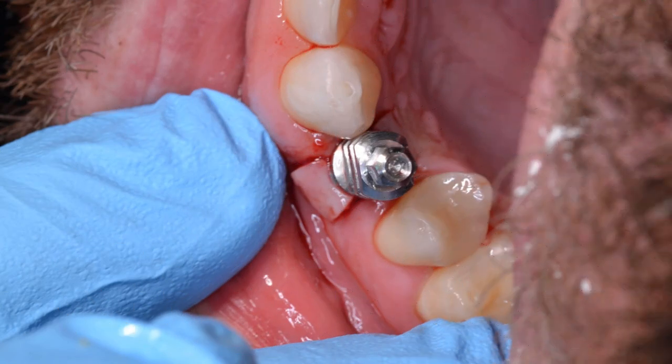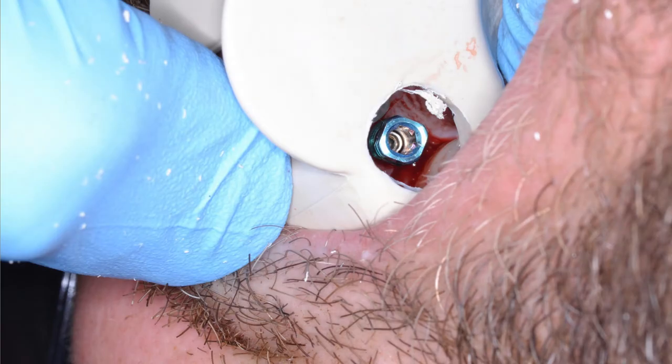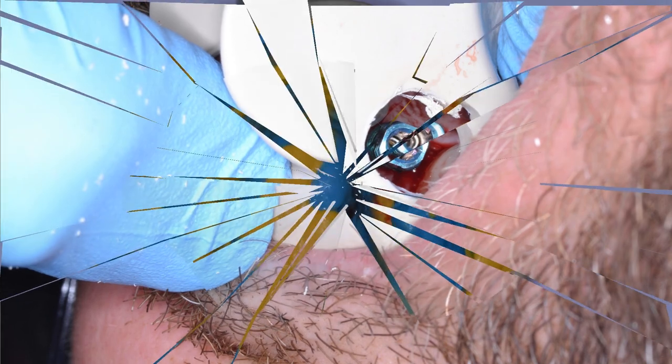So you can see the abutment in place. This has been torqued in. Here's a radiograph of it seated. You can see it's beautifully seated. There's a beautiful adaptation to that implant. And here is the final crown that's cemented.